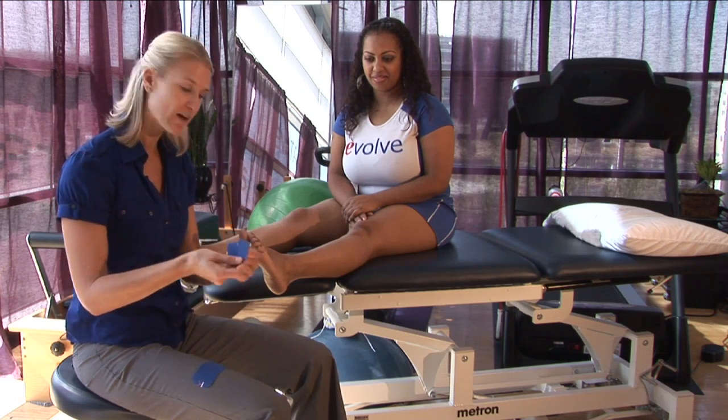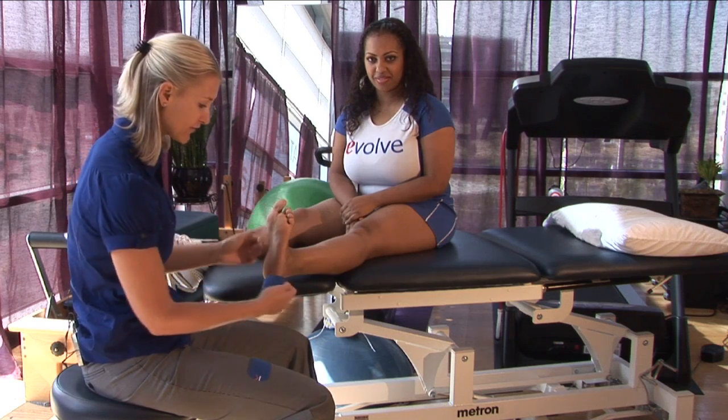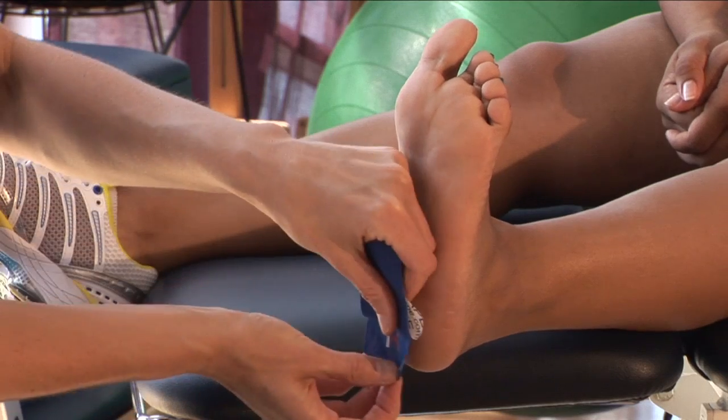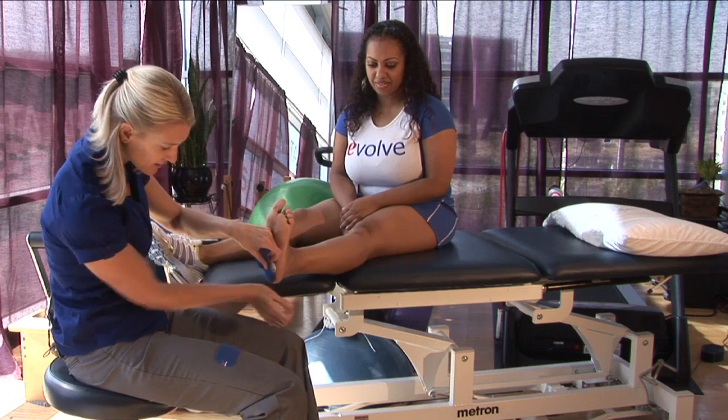I'm going to first take the Y strip and have Shantae pull her toes up so that we start in dorsiflexion. Pull off the base of the Y and put it at the base of the heel, tack it down, and make sure that it sticks.